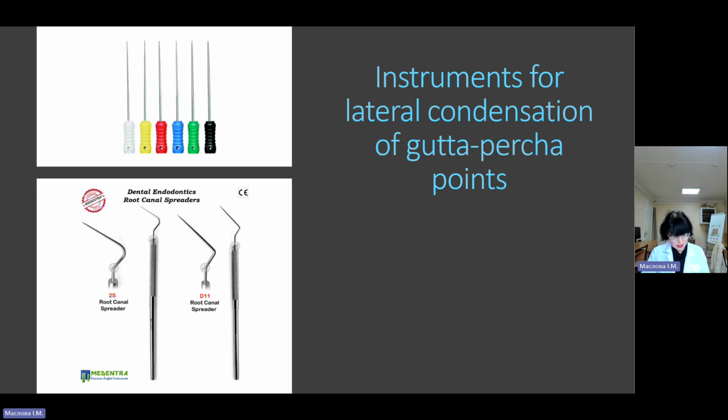Root canal obturation aims to seal the pulp chamber and canal system from coronal microleakage, prevent remaining microorganisms from proliferating, and stop microorganisms entering the pulp space through the apical foramen and other pathways: lateral and furcation canals, openings into the gingival sulcus, and exposed and open dentinal tubules around the tooth. Both quality canal obturation and a well-sealing coronal restoration are critical to long-term success.